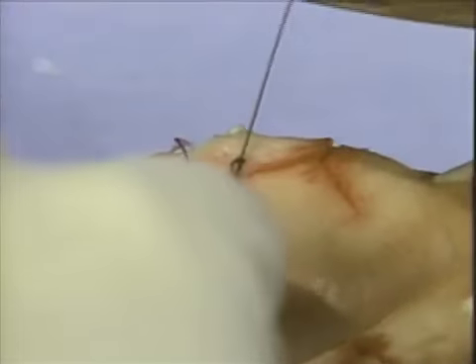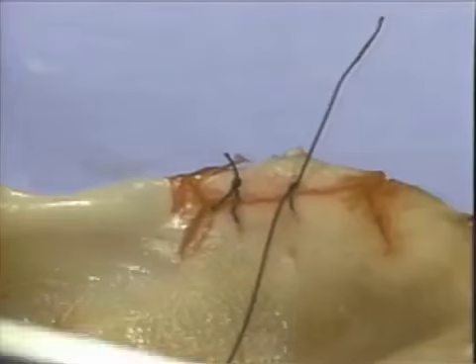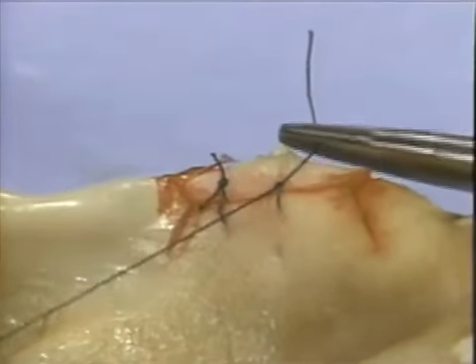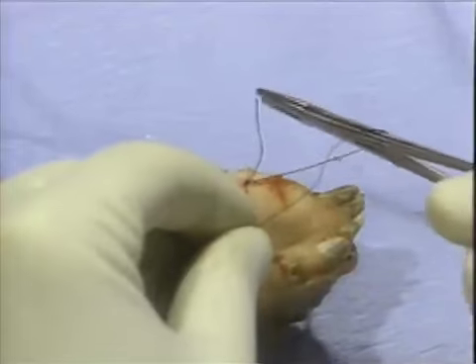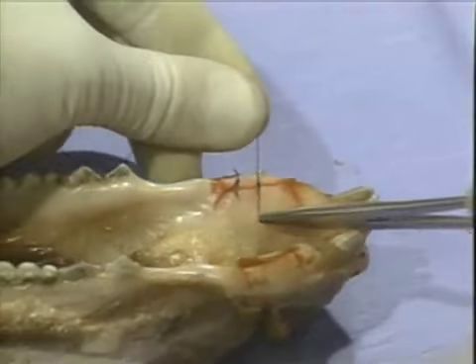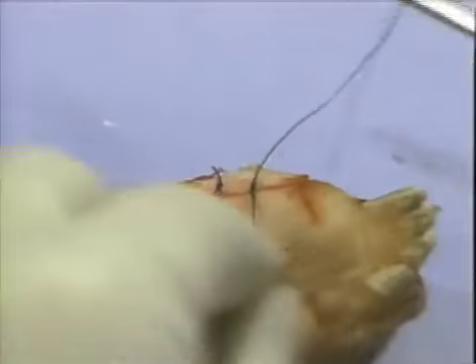The suture is tied with a typical surgeon's knot, usually by first making 2 clockwise turns with the hemostat, and tying down with an initial knot, followed by one counterclockwise turn on the suture, to secure the knot, followed by an optional clockwise turn to finalize the knot.